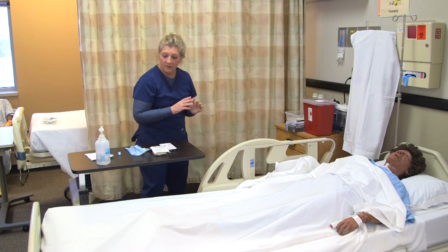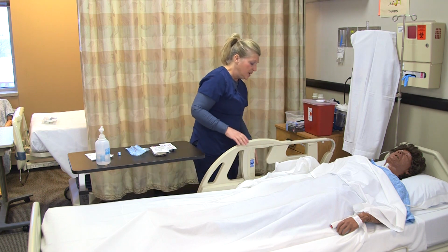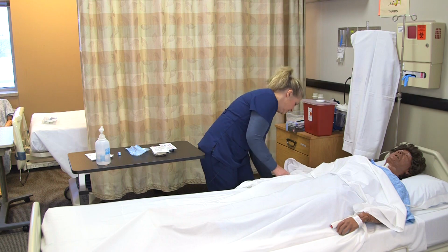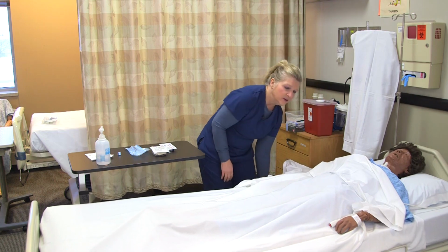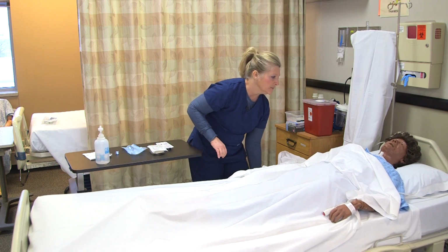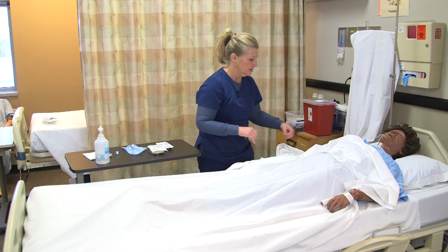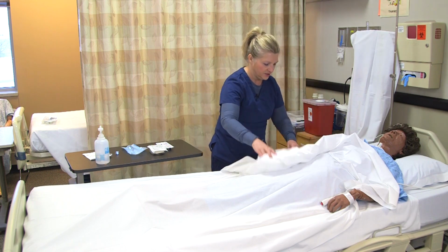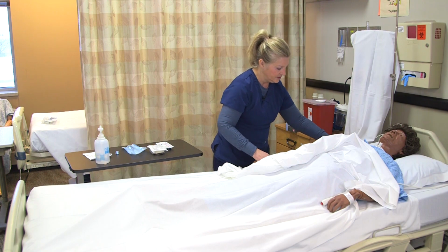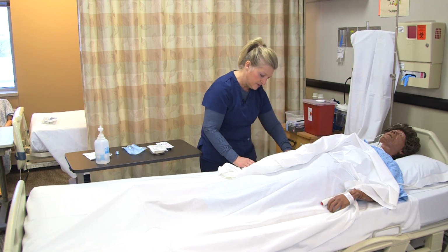All right, so now that I'm in the room, I washed my hands as I entered the room, but I'm going to go ahead, I checked the identification, I'm going to lower this side rail, and I'm going to raise the bed to a working height. And I'm going to explain to my patient what I'm going to be doing. Patient has no questions, they verbalize understanding, deny any past history of having problems with IV starts.